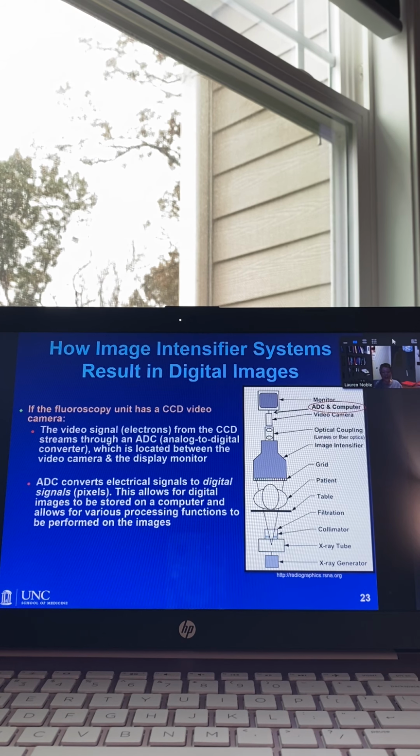I seriously doubt that you would be dealing nowadays with a unit that has a Vidicon, unless there is some old office somewhere in the middle of nowhere where they haven't upgraded their systems and they're still using film. Because when you use a Vidicon, the only way to get a permanent image is to use film to capture those images permanently.